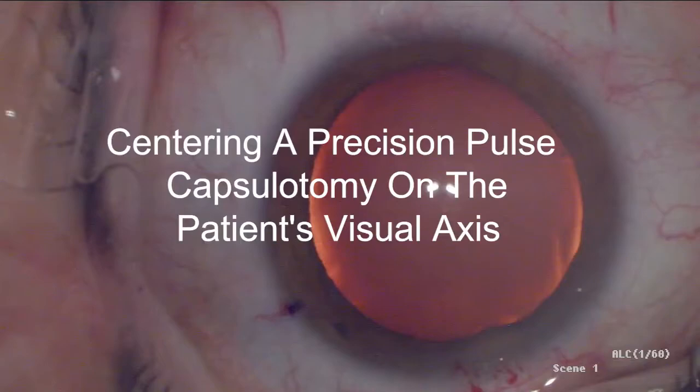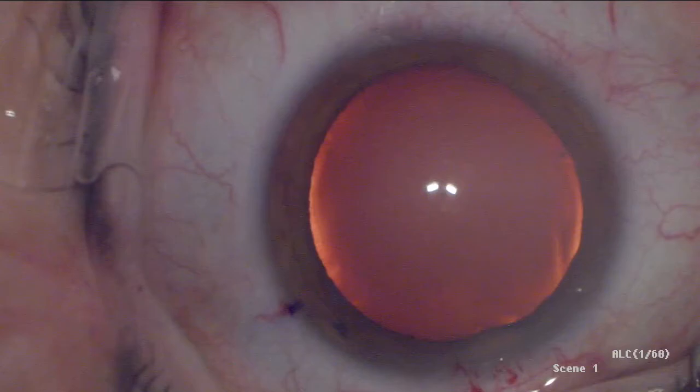This video shows the intraoperative use of patient fixation and the creation of a precision pulse capsulotomy centered on the visual axis. This capsulotomy is then used as a reference marker for IOL placement, thereby anchoring cataract surgery to the patient's visual axis. In this particular surgery, the patient was asked to maintain fixation on the left microscope light, while the surgeon looked through the corresponding eyepiece coaxial to this light.